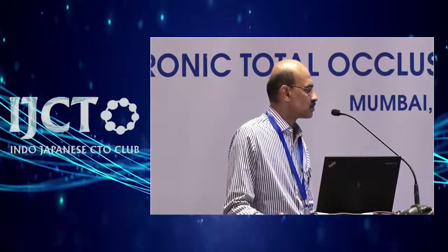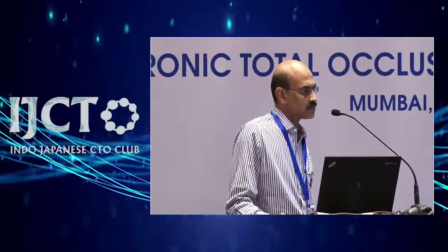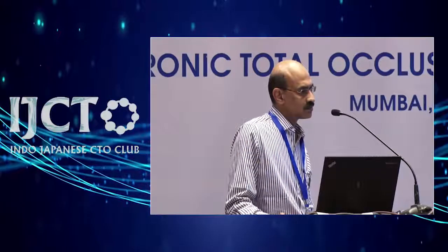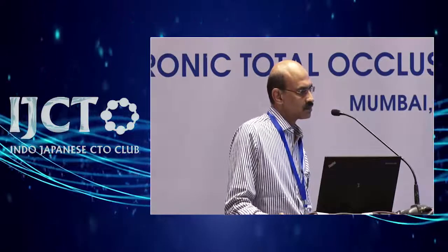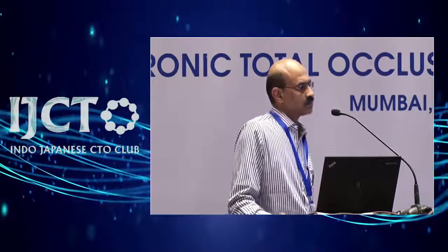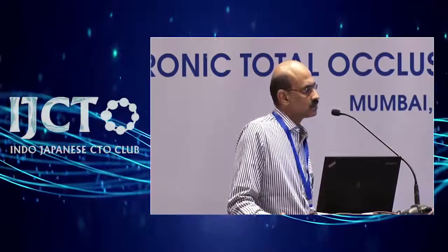Please, I think it was your case, isn't it, Dr. Laman? You keep the balloon inflated, it doesn't matter at all. There was a very large branch. This is a genuine problem if you are doing left system. When you have a balloon which you have used as anchor in a moderately large diagonal, then it is a big pain, and you have to intermittently deflate it.